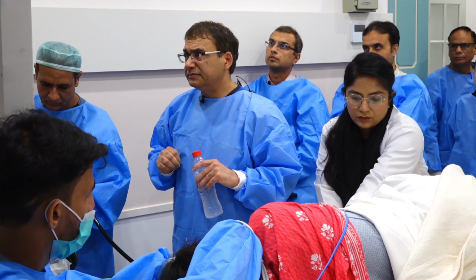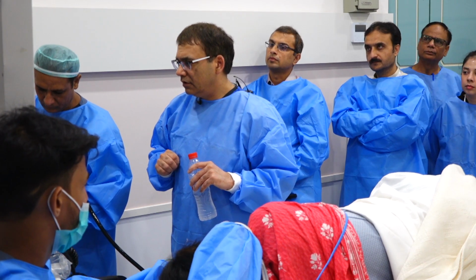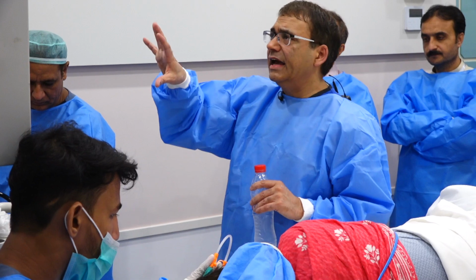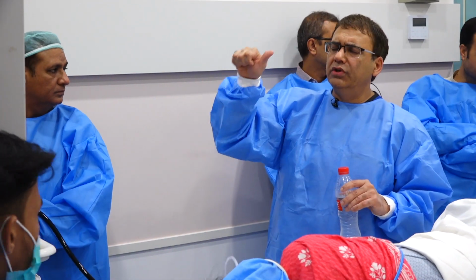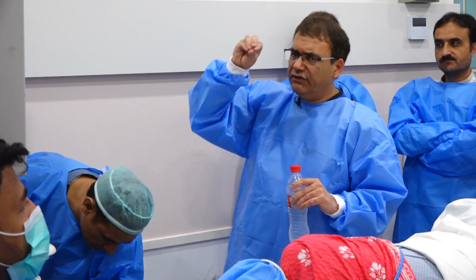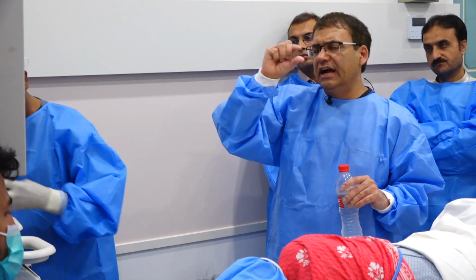Yeah. And Dr. Hassan, what would you expect to see in a tumor of the bile duct in a patient like this? So assuming that it was a cancer, what would your typical findings be? So bile duct, there was a lot of artifact. It was from stone there, air there, and stent in there. Usually what you see, if it's a bile duct tumor, you will either see a mass around the stent, or you will see a thickening of the bile duct.